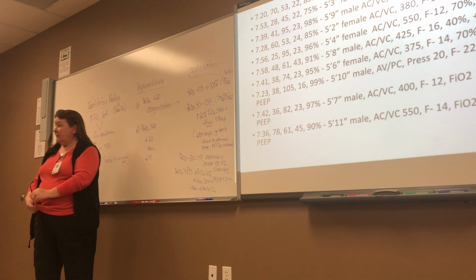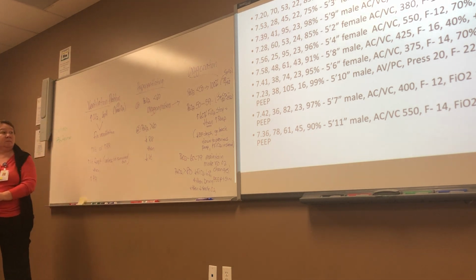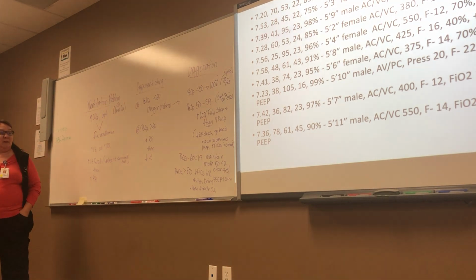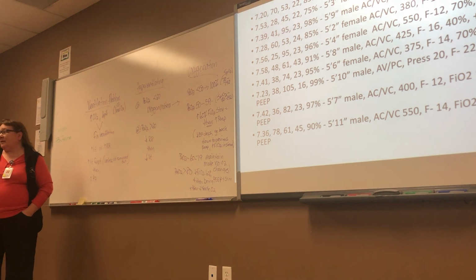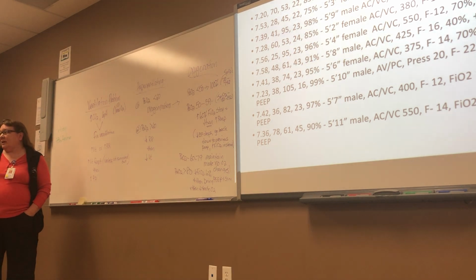So with the hyperventilating, what if they're already at a respiratory rate of like 10? How low are you willing to go before you switch them over to volume? If their rate's at 10 and they're still hyperventilating, then you have another problem. You have to figure out what's making them hyperventilate, because it's not you. So if they're hyperventilating, you always go rate first. We don't go below 8 unless we're going to try to wean somebody.